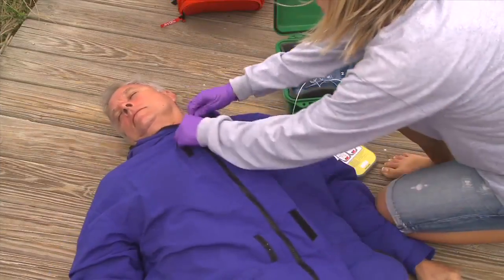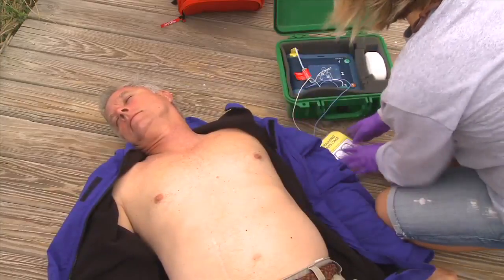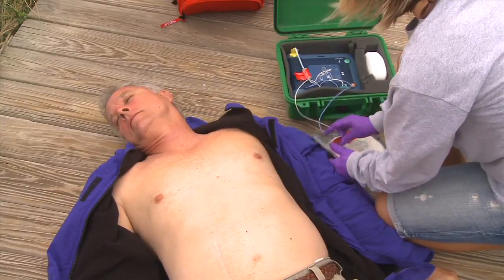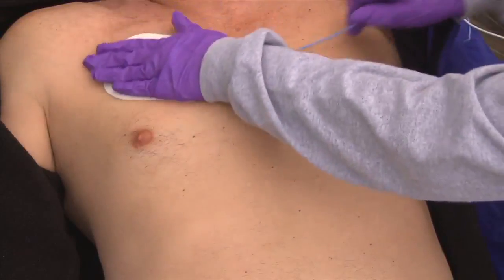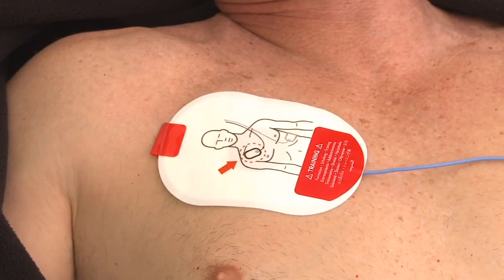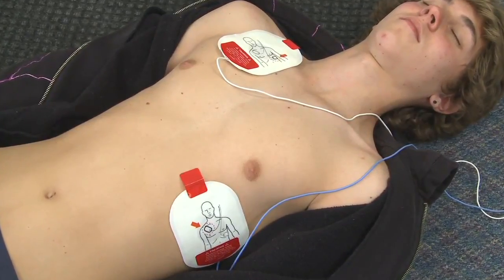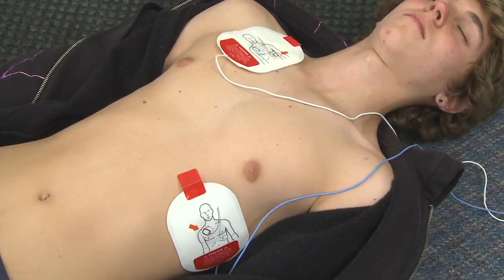Bare the chest, cutting away clothes, swimsuit, or bra material if necessary. Attach the defibrillator pads — they are marked to show proper placement. However, if you get the pads backwards, don't worry; the AED unit can still read the heart rhythm.